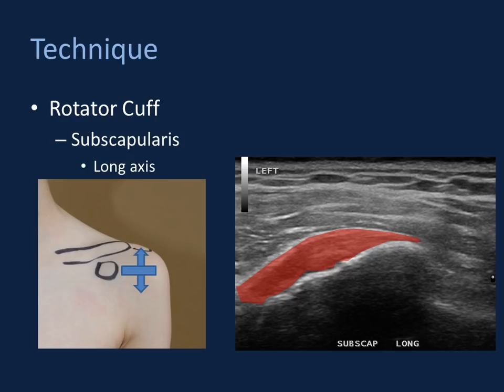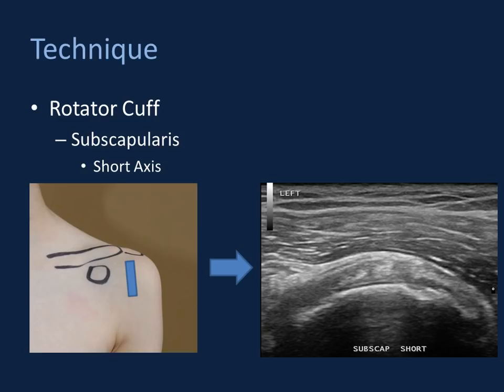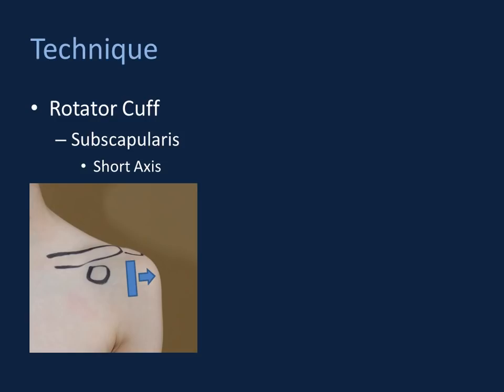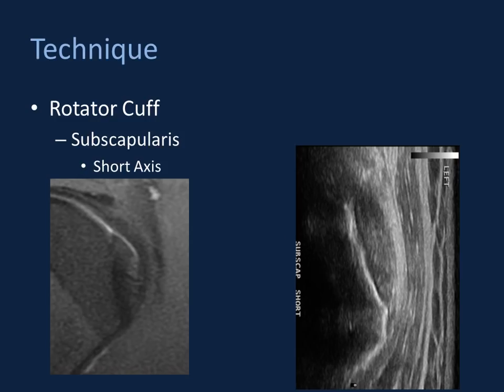To obtain short axis imaging of the subscapularis, rotate the probe 90 degrees. At the level of the humeral head just beyond the myotendinous junction, you see relatively smooth and symmetric subscapularis tendon tissue over the humeral head. Sweep peripherally to see the entirety of the tendon out to its bursal-sided insertional fibers. At the footplate, you see subscapularis tendon tissue attaching onto its footprint at the lesser tuberosity. If you rotate a short axis sonographic image 90 degrees — analogous to a sagittal MR image — you'll see how similar the subscapularis tendon appears on both.